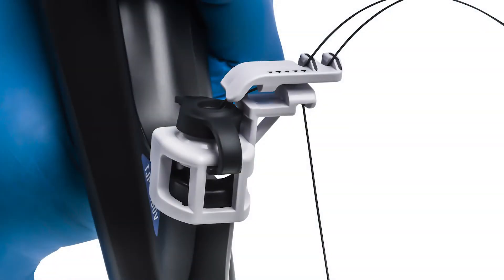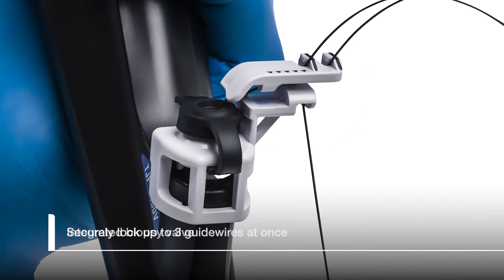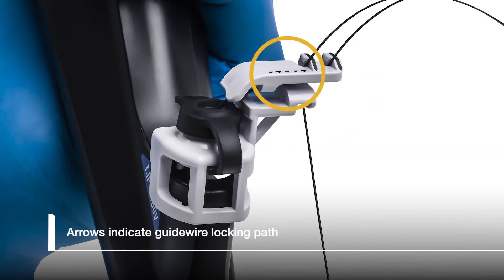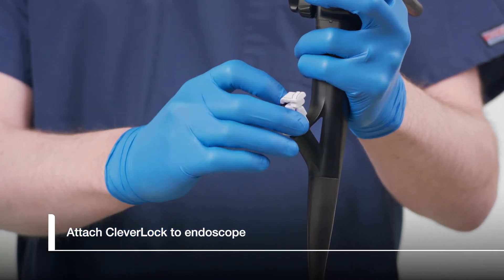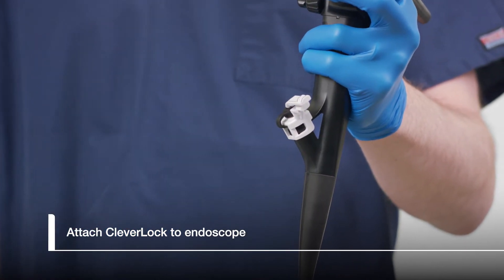The CleverLock Guidewire Locking Device securely fits onto the biopsy port of an Olympus duodenoscope. CleverLock features an integrated biopsy valve. The locking device is comprised of a locking arm with three slots for securing guide wires. The guide wire is passed through the channel in the locking arm and into one of the three locking slots. Black arrows on the top surface of the lock indicate where the locking arm channel is located. Carefully attach CleverLock onto the biopsy port by aligning the locking arm away from the endoscopist and pushing straight down until a click sound is made.